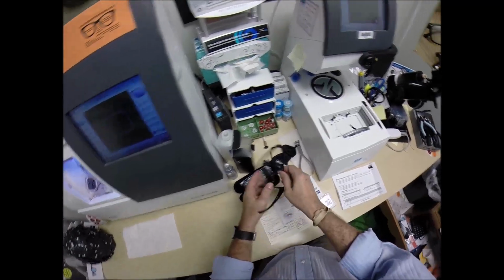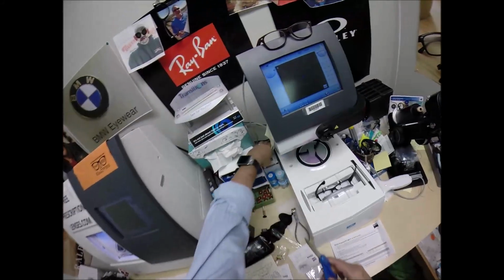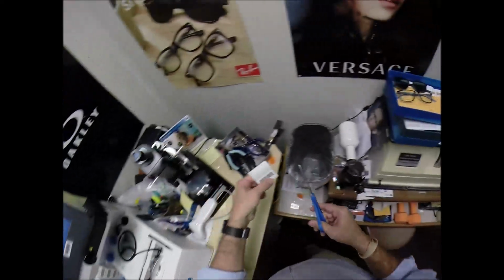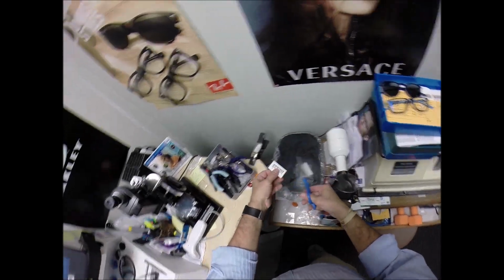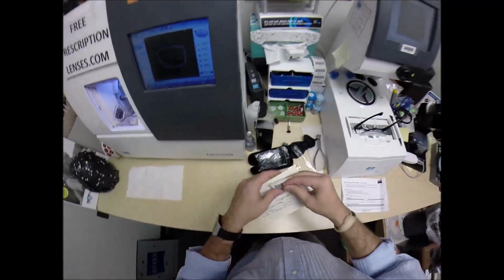So, let me go ahead and pop out the original demo lenses that comes with the frame that you will be receiving. Put your frame into the tracing element of my blocker. I need to assign you a sticker number. You are going to be 2349. Grab my paper clip, put that on there.